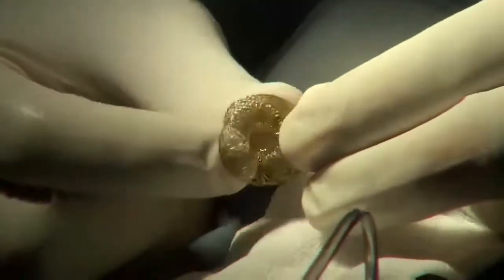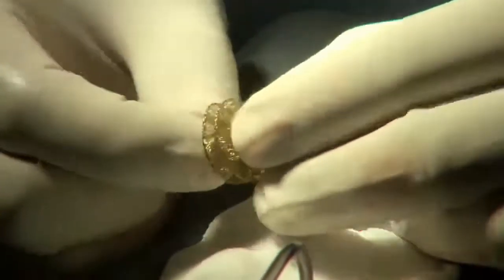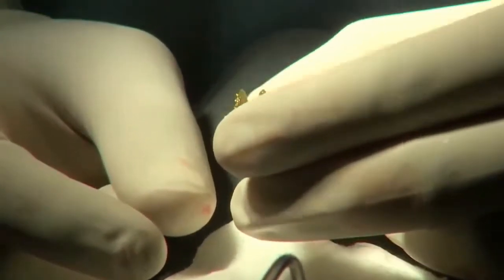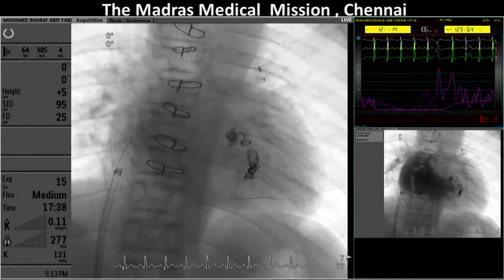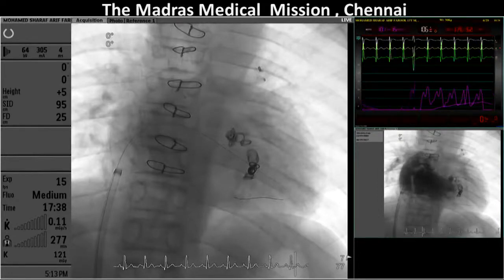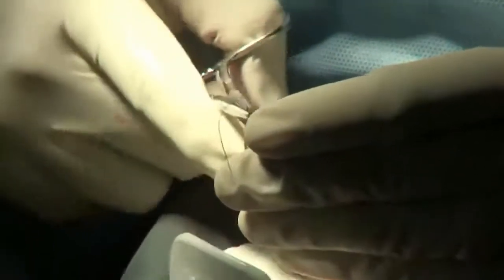And you have a high pressure gradient between the Fontan pathway and the left side or the atrial side of the heart. This high pressure gradient, in combination with the anticoagulation, and this patient should of course be anticoagulated in this kind of situation, from what I think and what I've seen, I think this is absolutely fine. And if you start now to manipulate a device which is completely new, I think you do harm to the device, and I think this is not a good approach, sorry to say.